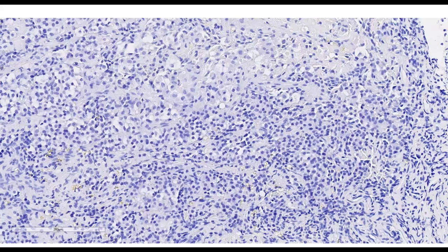Okay, I don't have an H&E. The H&E was not digitized. Sometimes we're supposed to have all the neuro slides. H&Es are digitized, but oftentimes they don't make it. So we always have to check. And if they're not, we have to look for the H&E to make sure. I don't have it. You know, it's okay. This is one of the negative immunostains. It's hematoxylin only. It's fine. It is fine.